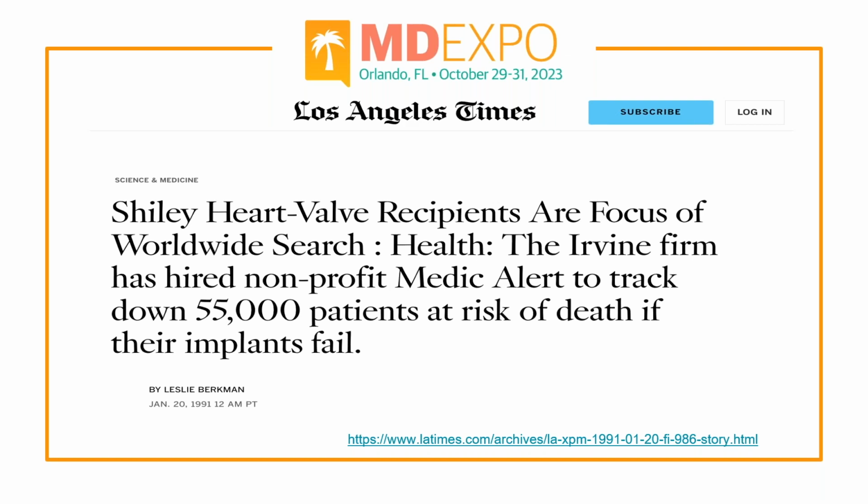This is a clip I came across. Look at the date here, 1991, before the SMDA was passed. The origin behind this is an interesting piece of history, if I can take 10 seconds to talk about it. They had heart valves in patients which were failing, and they did not have a clue which patient it was or where that patient was.